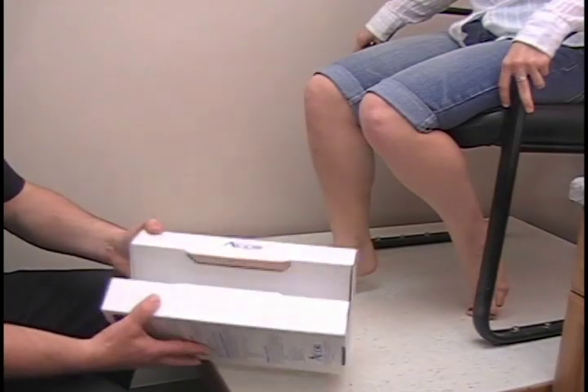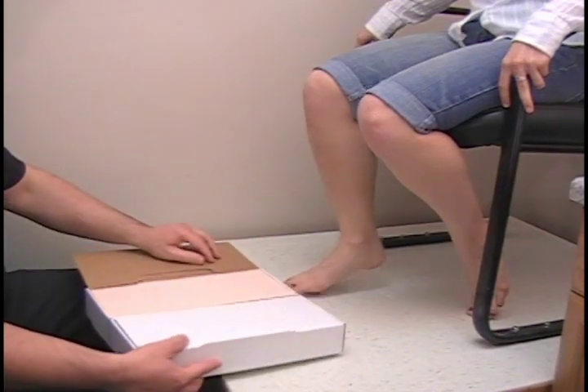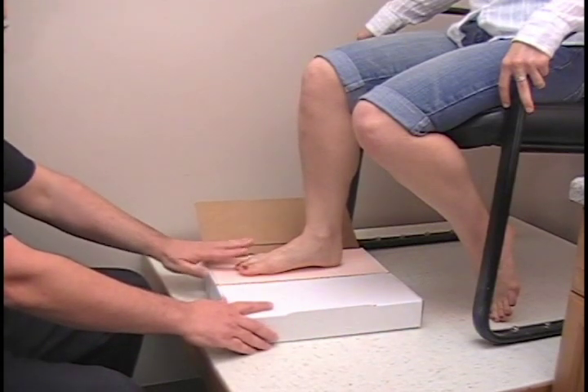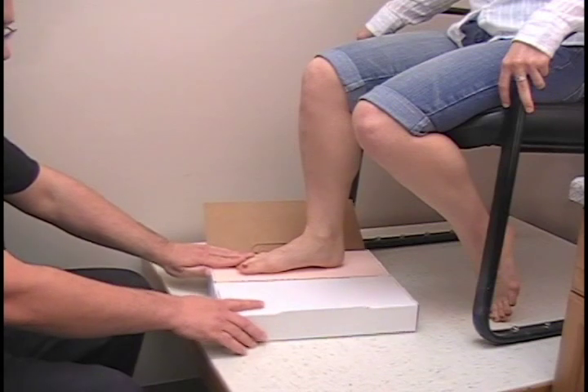Hello and welcome to an ACOR Orthopedic Educational Tutorial. My name is Ross Marty and I am Director of Clinical Education for ACOR, and I will be your instructor for this series. So you need a box of impression foam. It's pretty easy. I am going to open up the box. The patient will pick up their foot and lightly set it right in the center of the box. One thing nice about casting with your foam, you can adjust the arch pitch by changing the dimension of the box.